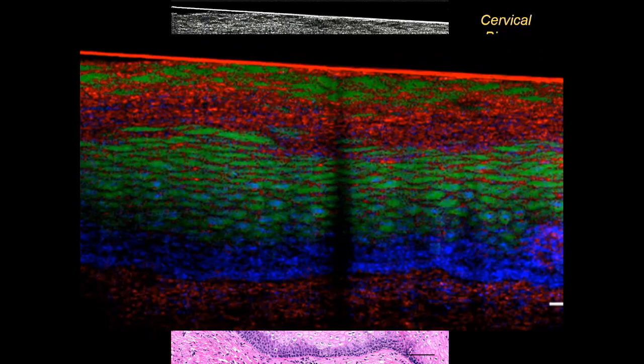And even more interestingly, as the cells mature and lose the deep blue, you can still see that there's a little bit of hazy blue in them around the nuclei. That's because that's where the organelles are actively making proteins and transcribing mRNA, and they are causing molecular motors to move those organelles around the nucleus. And we can actually see that on dynamic micro-OCT. So that's why there's a perinuclear blue halo around all of these cells, because that's where the metabolic activity is in protein production.